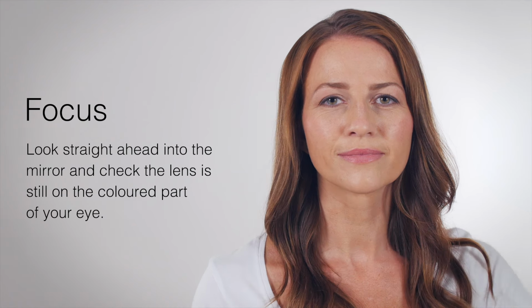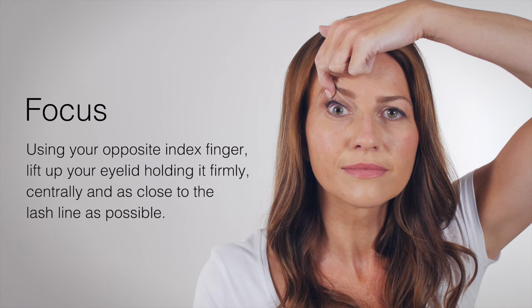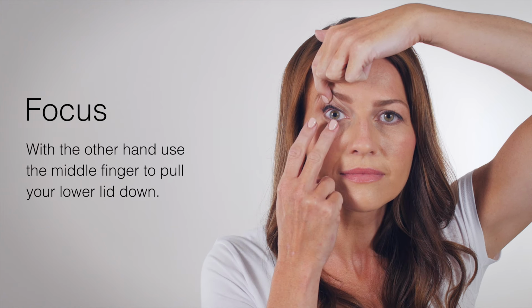Look straight ahead into the mirror and check the lens is still on the colored part of your eye. Using your opposite index finger, lift your upper eyelid, holding it firmly, centrally, and as close to the lash line as possible. With the other hand, use the middle finger to pull your lower lid down. Again, place your finger as close to the eyelashes as possible.